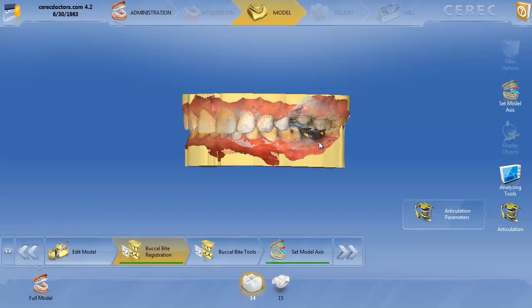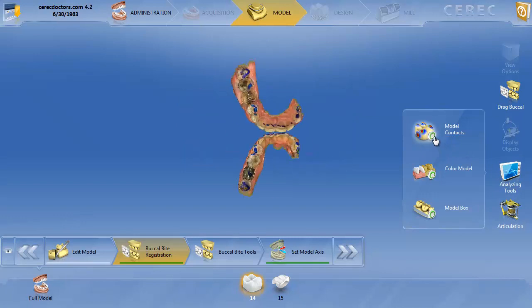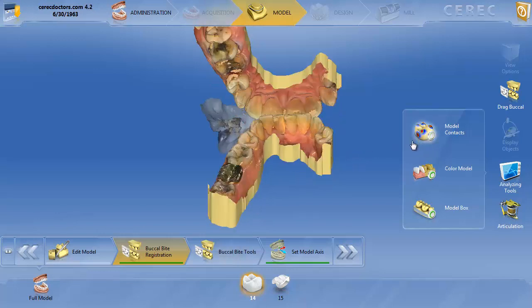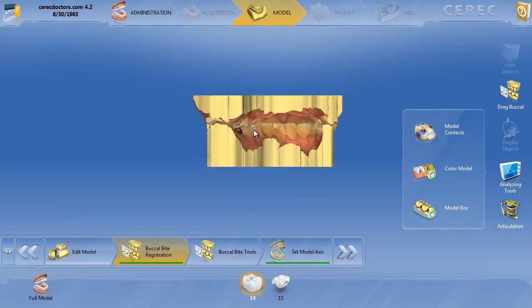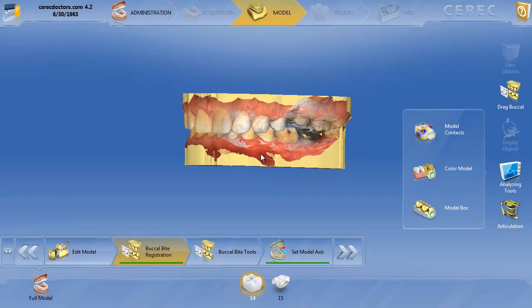It's not a new theory at all — it's been around for a long time. Basically, this is going to function on three different things. The first is going to be the importance of the actual articulation itself — the contact points between the teeth. If we look at these model contacts, these little contact points, we want everything to be in contact correctly with no penetration. This is basically going to rely on the accuracy of our buccal bite. If the buccal bite is accurate with these full arch models, then step one is actually satisfied.